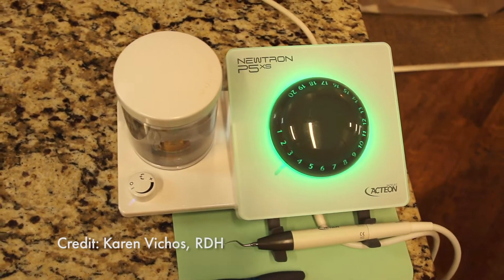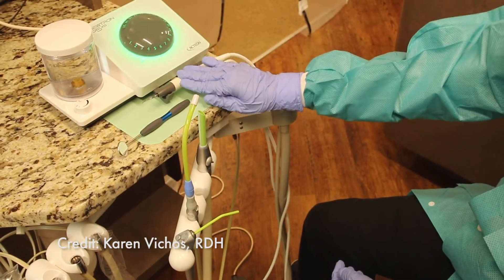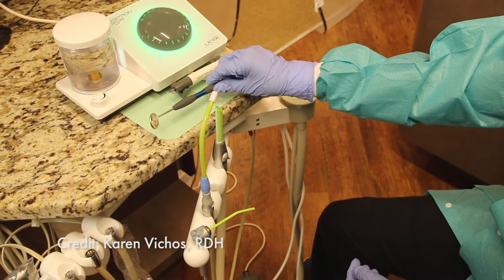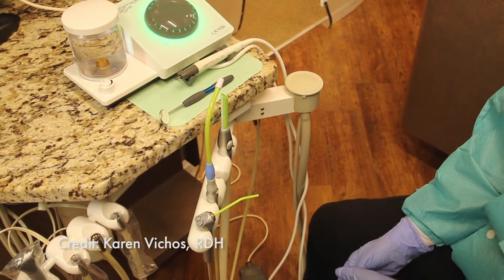The purpose of this video is to show how I utilize my Acteon Newtron handpiece along with my HVE, my low volume suction, and my hand mirror at the same time during an adult prophylaxis.